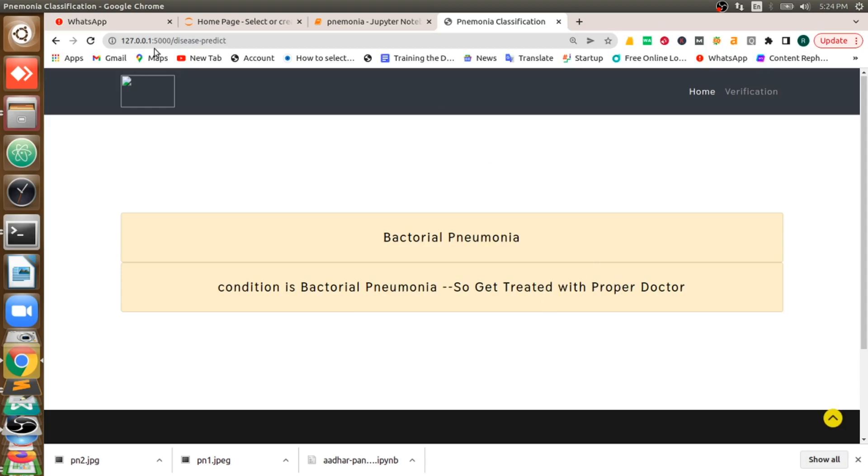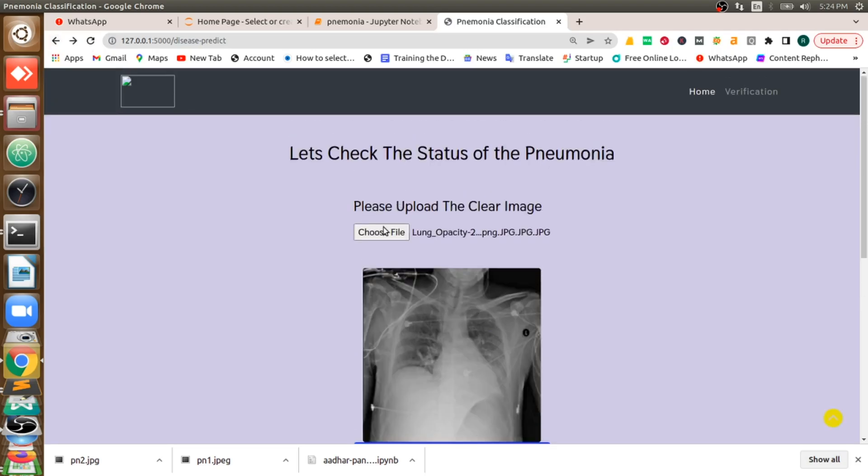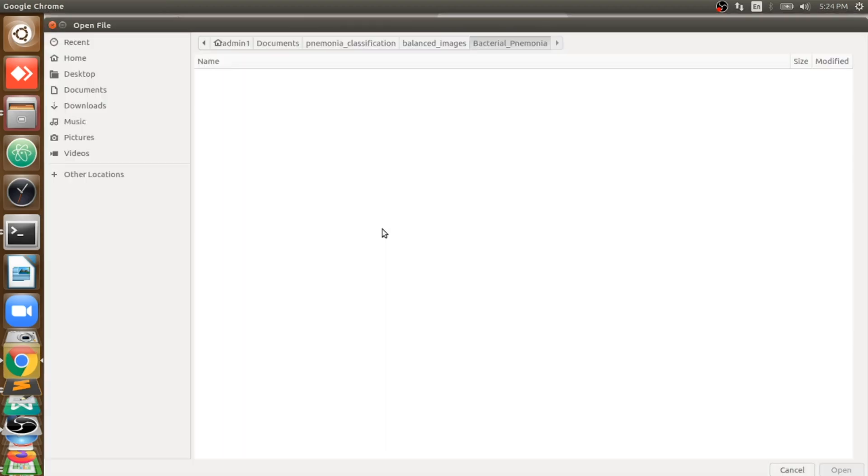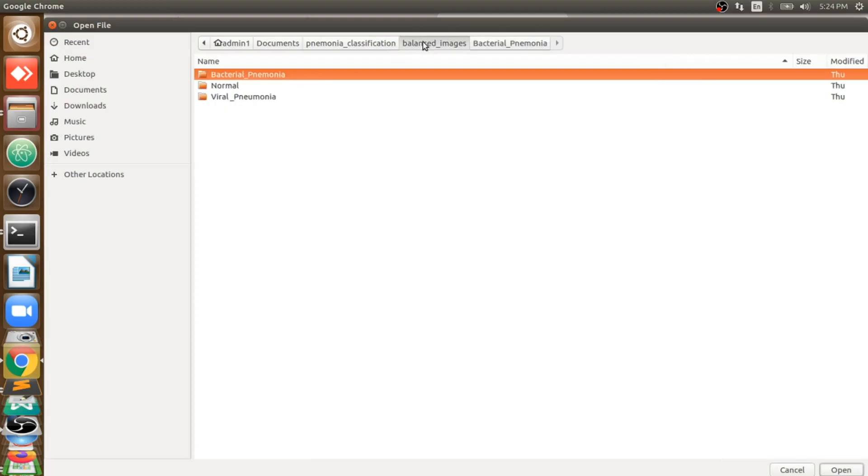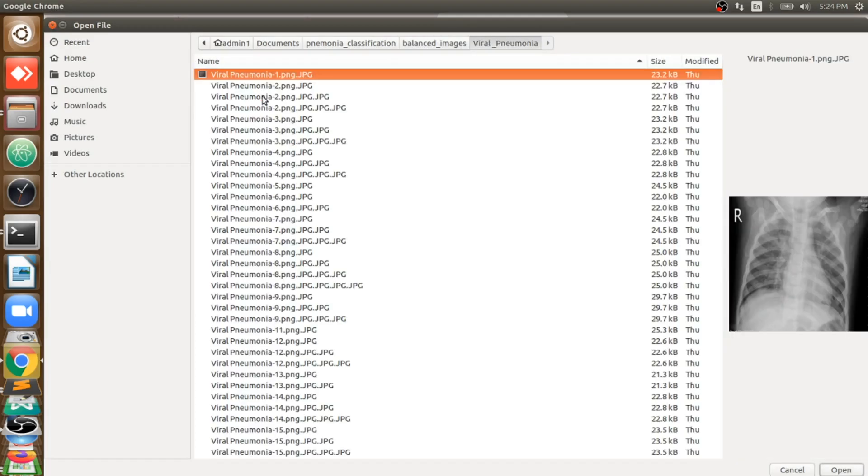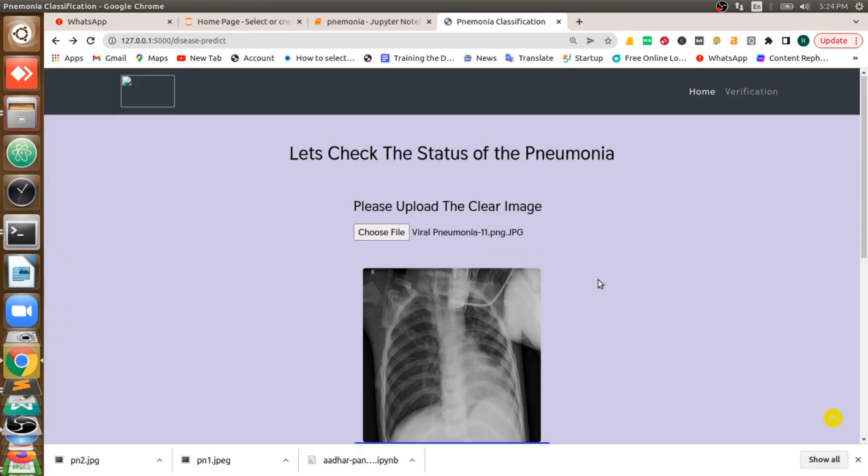This is not enough for us. You can test it on some other images. Our model is working very very good. So we'll test it on viral pneumonia. Let us take some random image.